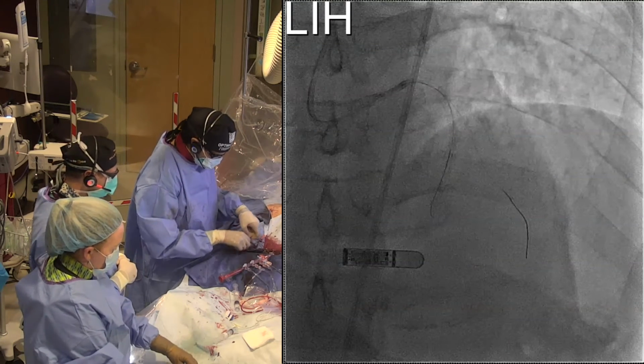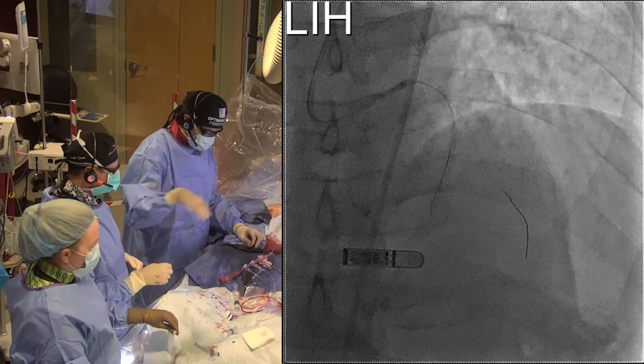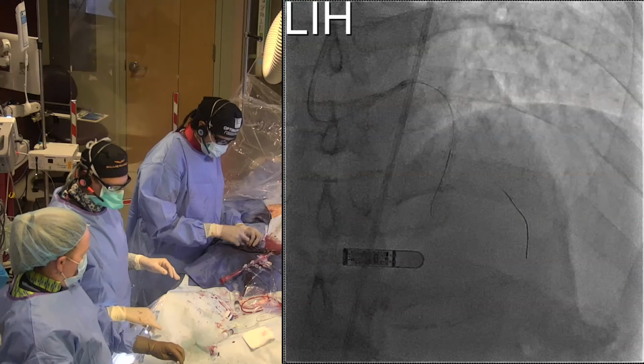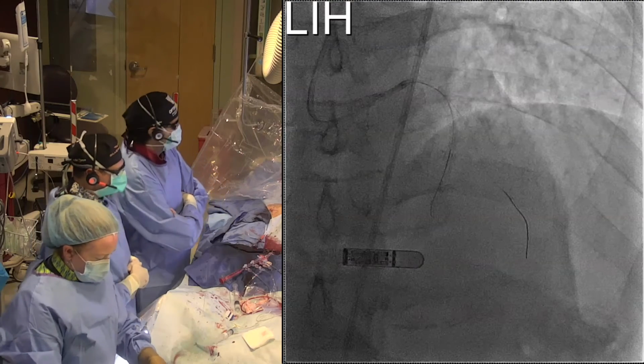You might be right. I might pay for this, but my preference is that if there's no pressure drop across the ostium and we don't have to mess with it, I prefer not to mess with it. Well, there is a pressure drop, but it's pretty small, right? It's not a critical pressure drop. Certainly not enough to embark on a bifurcation stent. Right, and then I'll have to do kissing balloon inflations, et cetera, et cetera.